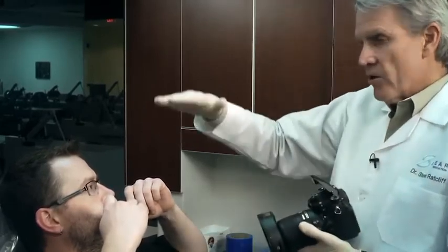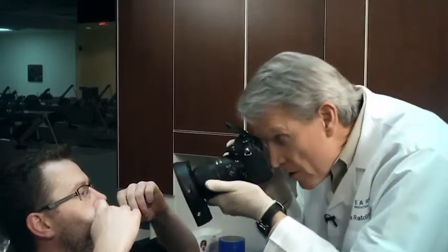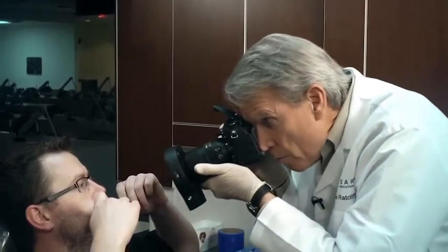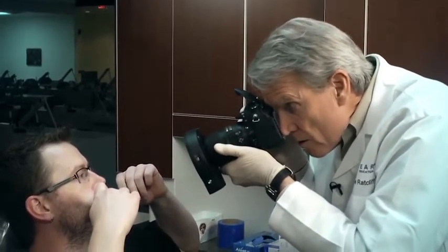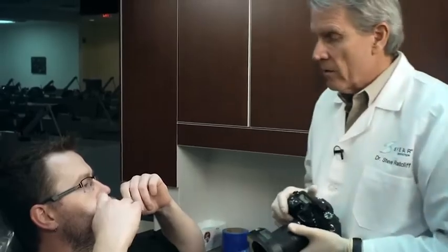Now I have the chair set up high because I don't want to have to bend over when I'm doing this photograph. Scott's teeth are already dry. If there was saliva on his teeth, I would have Elisa blow air across and remove any saliva bubbles so we get a clean photograph. So my camera's set up. I'm going to move in and out until it's in focus and take the picture. And that's all there is to it. Go ahead and take the retractors out. Thank you, Scott.